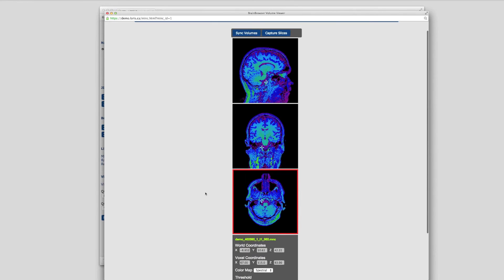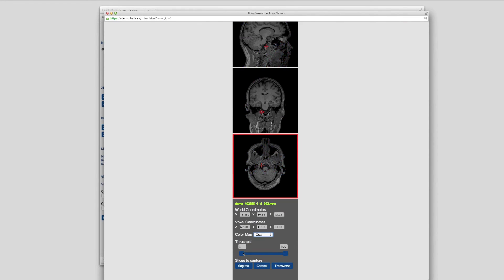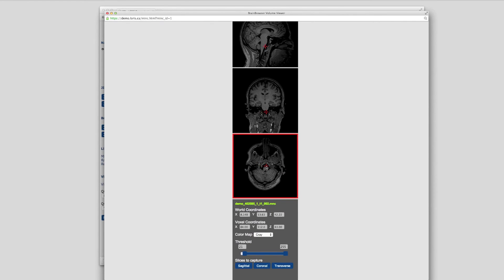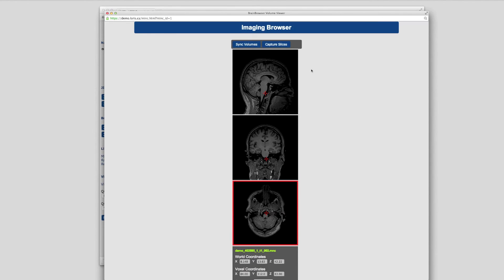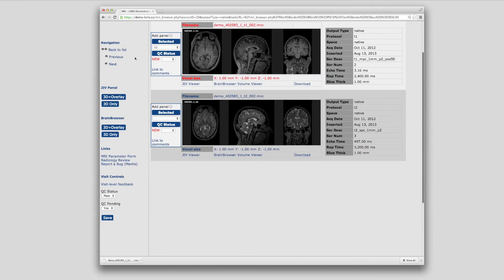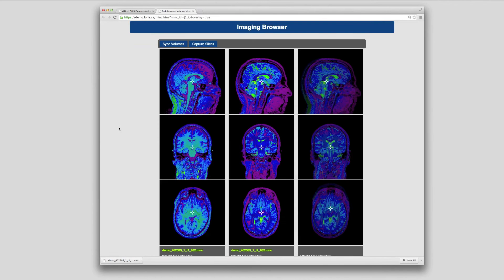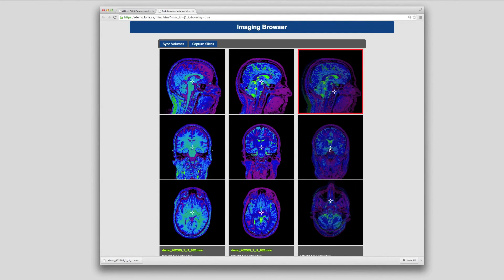This is useful for the radiological review process, which is a special separate module in LORUS not covered in this video. It's also useful for visual quality control of scans. No installation of special software on your local machine is required — simply an up-to-date web browser. Two volumes can also be overlaid to check for discrepancies between volumes, shown in the third column on the right.